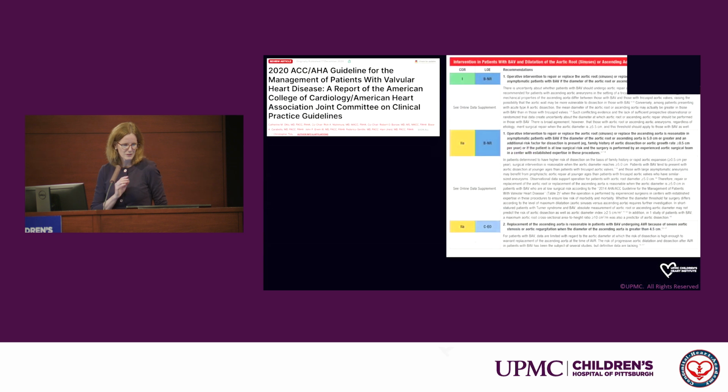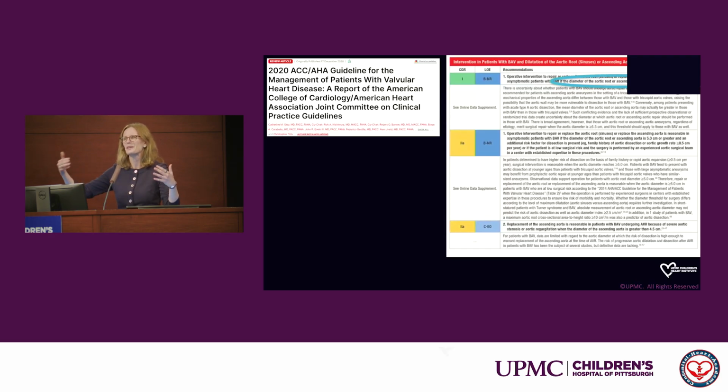Okay, so just briefly to be aware of, I'm sure we all are aware of, but just to remind us all about some of the guidelines of this space. So this is the valve management guideline that talks about when it's appropriate to manage or replace or surgically address aortic root dilation. So the one number to keep in our minds, for cross-sectional imagers, the thing we're looking for with cross-sectional imaging is an accurate root measurement.